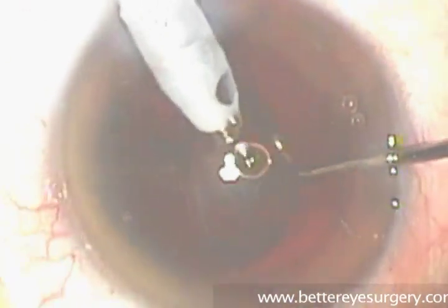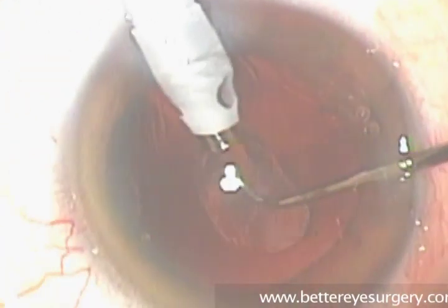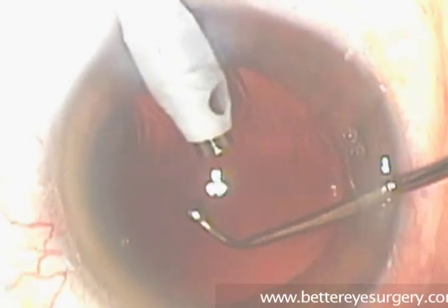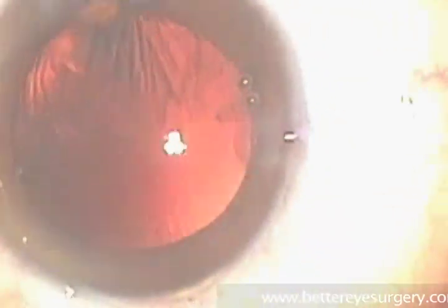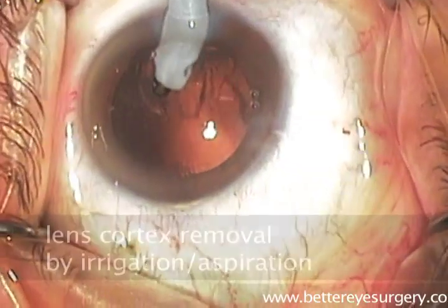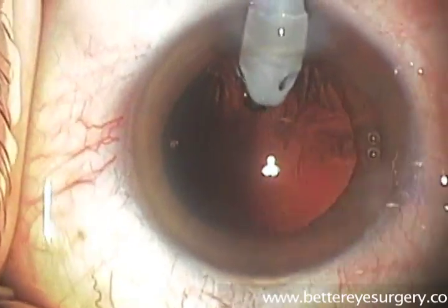As the last bits of the nucleus, or central part of the lens, are removed here, we can not only see that the capsule around the nucleus of the lens is still intact, but also that there are some subtle remnants of lens material — whispery, feathery pieces — that need to be removed in the next step, which is called irrigation aspiration.